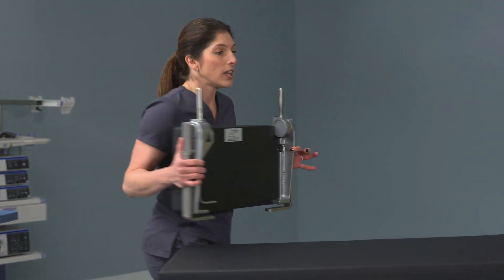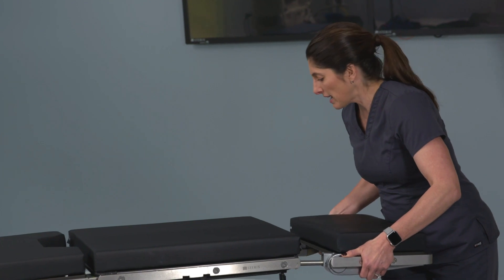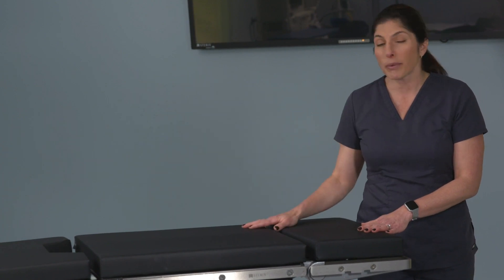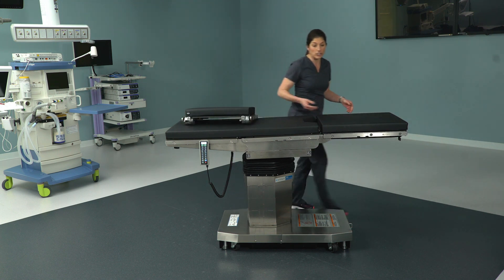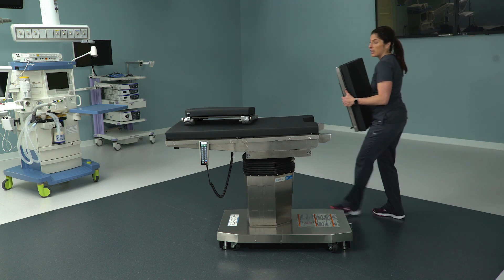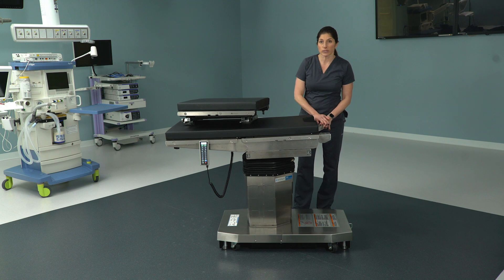You can take the head section, bring it down to the foot, and use it as a table extension to support the legs before getting the patient up into lithotomy. Once the patient is up into lithotomy, you can remove the head section. And now you can also remove the leg section — rather than just lowering it down out of the way, you can use the hand control to lower the leg receptacles.